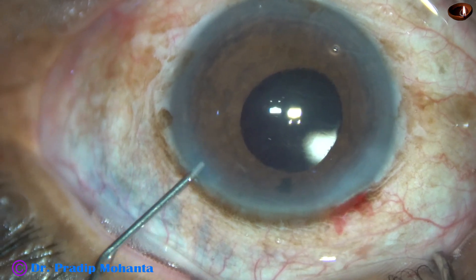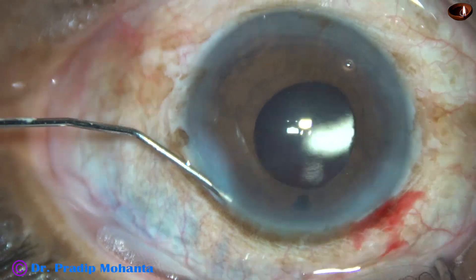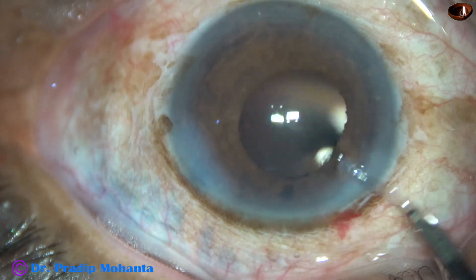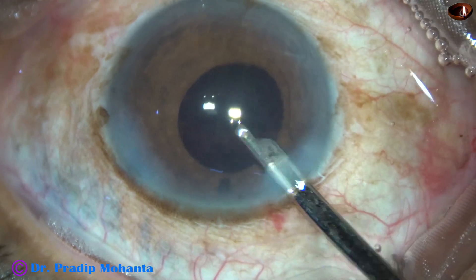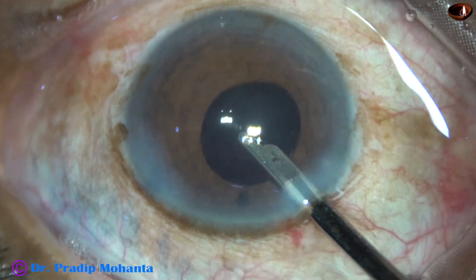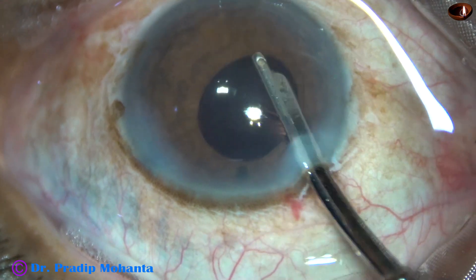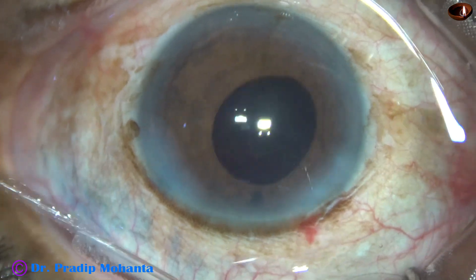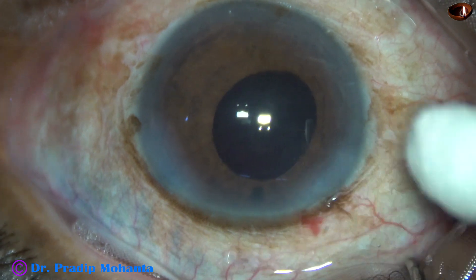We must do this step religiously if we want a clear cornea the next day. Otherwise the cornea will be steamy and hazy because of raised intraocular pressure. The side port is closed by hydrating the corneal stroma on either side of the wound. The main wound doesn't need any hydration. This is the final lavage of the anterior chamber, and then the anterior chamber is very nicely formed. The case is concluded — there is no leakage from the main wound.